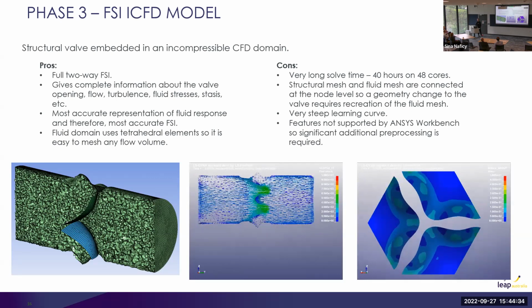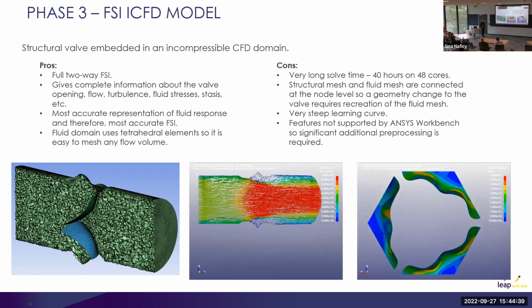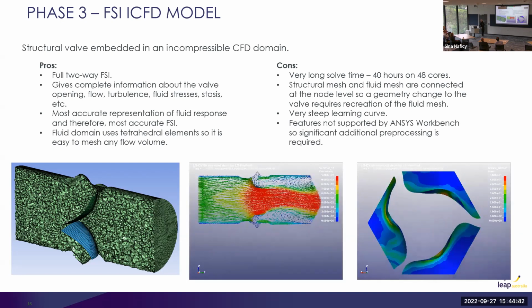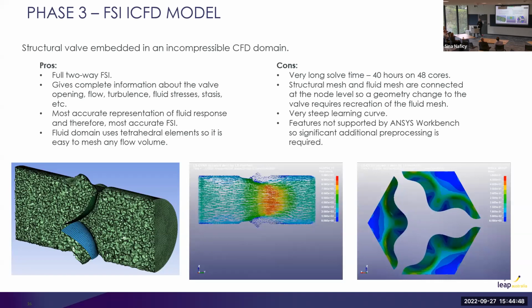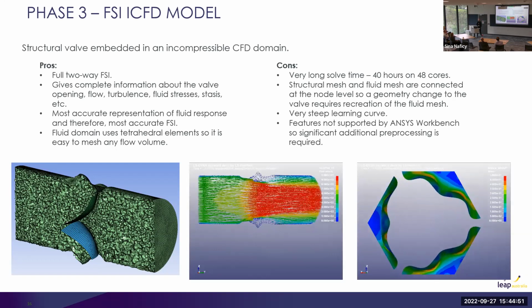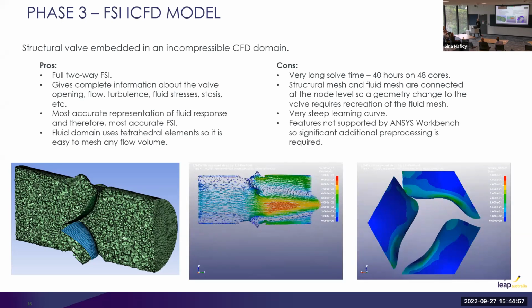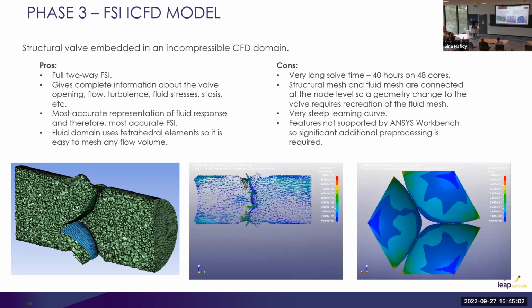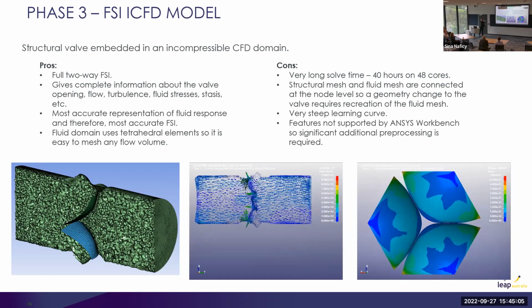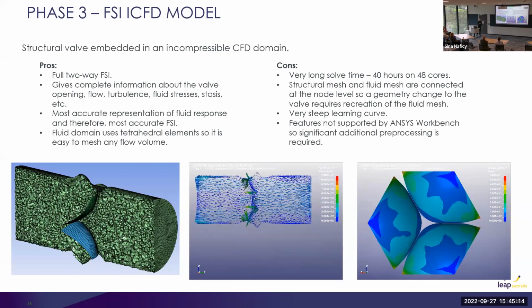So that's much better. But yeah, you can get all this nice behavior here where we've got the flow changing direction, some fluttering happening, and then closing again. Also, one thing I should mention is a bit of a trigger, probably a trigger warning. These valves are all using linear, isotropic, homogeneous material models. So all that fancy material science you've been talking about all day, none of that is here. That's just the most boring, simple material model you can imagine. But it's what we use to get a basic model working. This flies now, we know it works. Now we can go to town.